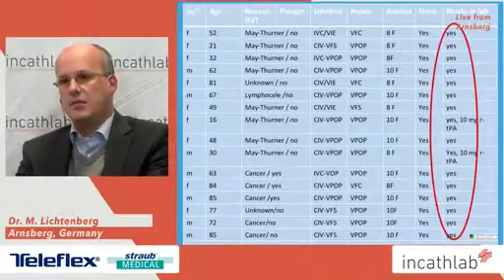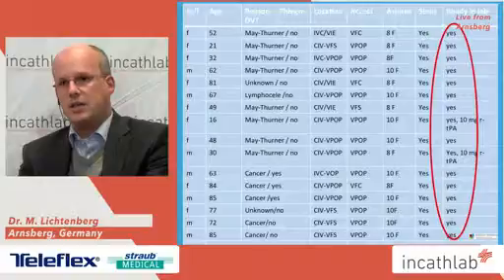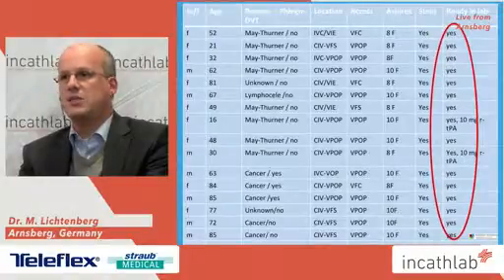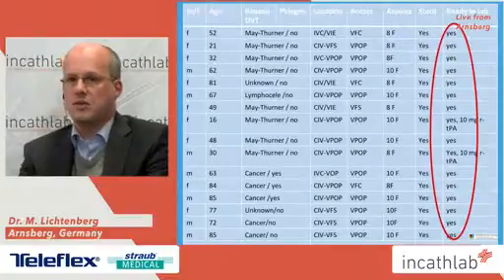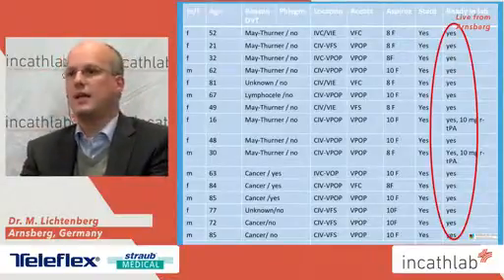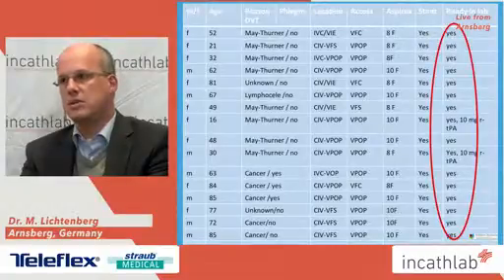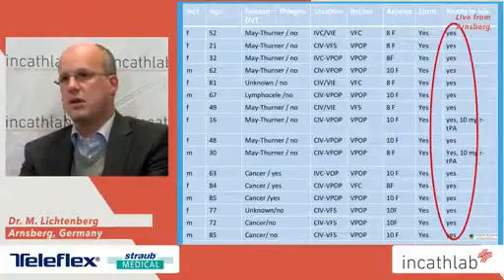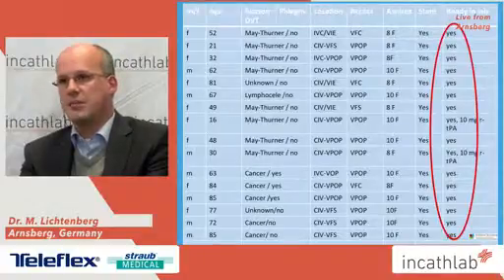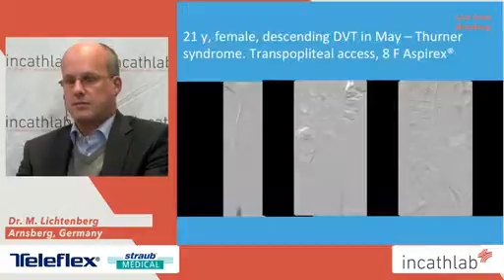And the other thing I would like to show is that in our patients we did not need any thrombolytic therapy. Only in 2 patients we gave a bolus of TPA, 10 milligram TPA. No patient received prolonged thrombolytic therapy because we finished with all patients in the cath lab with an effective thrombectomy.